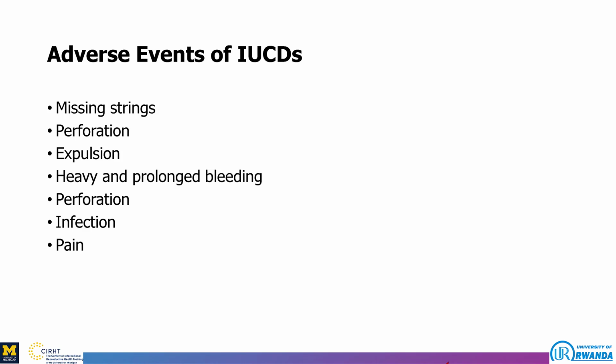And of course, infection can also occur, but the infection is not due to the intrauterine contraceptive device. The infection may occur due to poor hygiene. If the person who is inserting the device did not respect infection control technique, then the person may introduce infection to the uterus through ascending infection to the uterine endometrium.